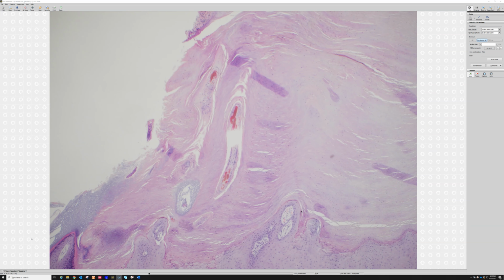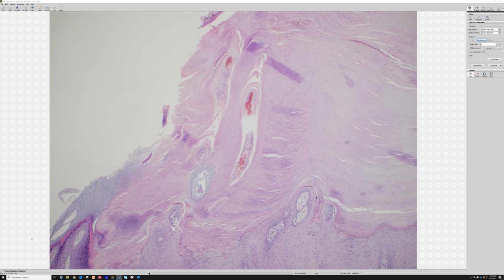So say I had a biopsy just like this. Well, this is one where I might say, you know, this could represent a wart, but there's some glassy atypia and it's broadly cut across or transected at the base of the shaved biopsy. And so I'm not sure it's representative. I can't exclude something more aggressive underneath, like a squamous cell carcinoma. So I add some comment to that regard, and I'm going to release some comments about how I handle complex situations. And when I get around to doing that, I'll put some examples of how I word my comments in my report, and you can check that out. Again, I'll put links down below so that you can go and see how I end up wording these things in real life.